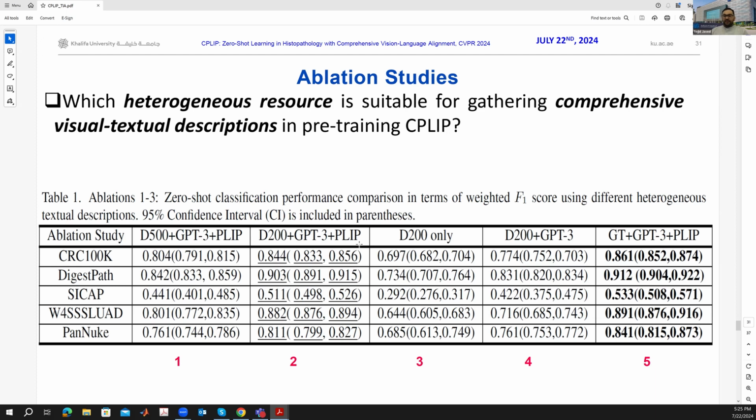And you can see that the performance is then improved compared to the unclean version of our dictionary. Then one can say that, okay, fine, we have a dictionary of only 200 words. Why not apply zero shot classification here, to align your histology images with the dictionary? So you can see that the performance is not that attractive compared to the proposed algorithm.